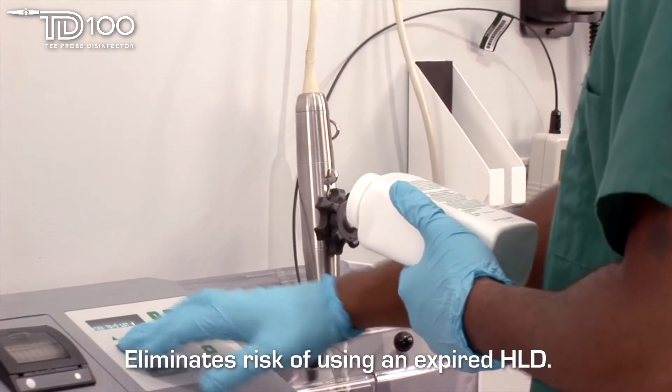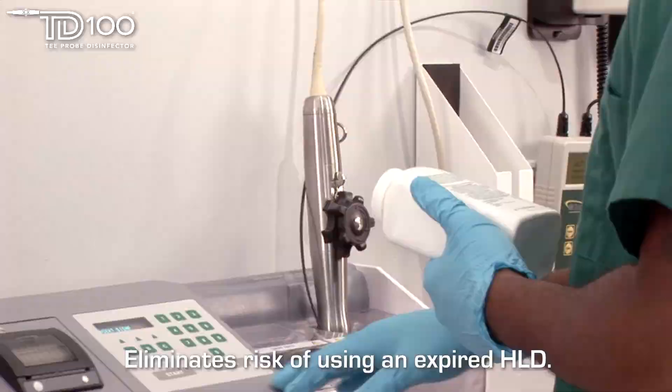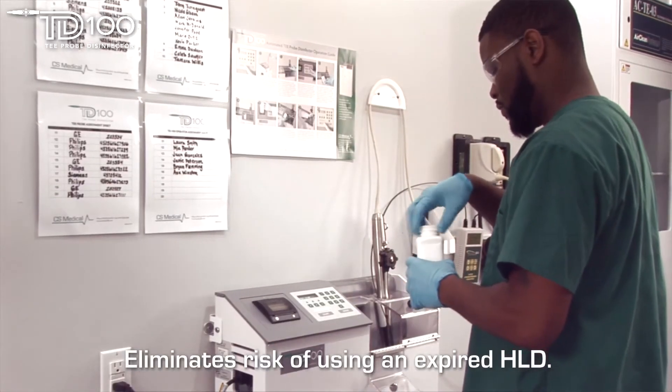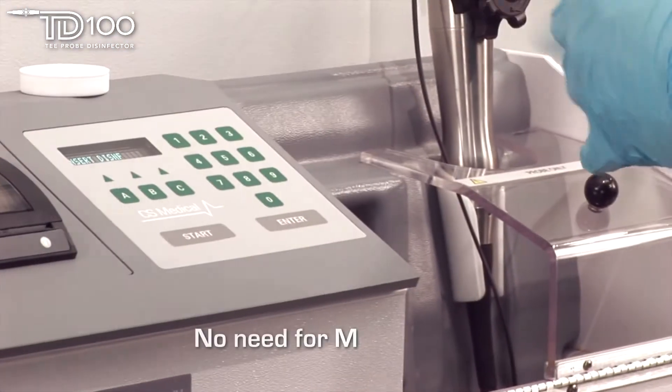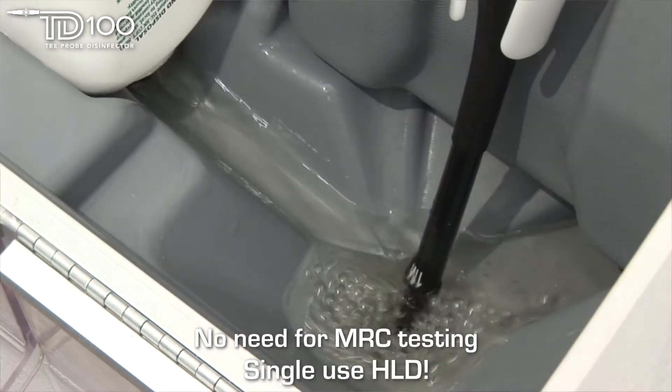The TD100 eliminates the risk of using a high-level disinfectant that is expired or that does not have the correct MRC to achieve high-level disinfection. No MRC testing is required since the high-level disinfectant delivery method is single-use.